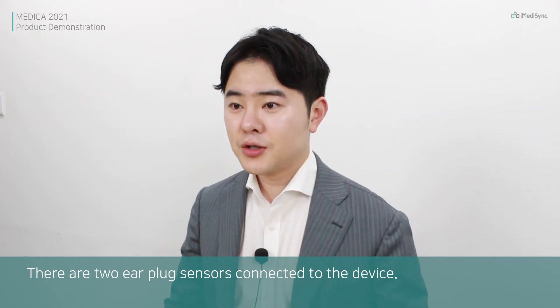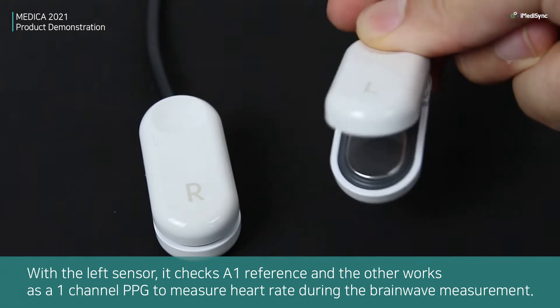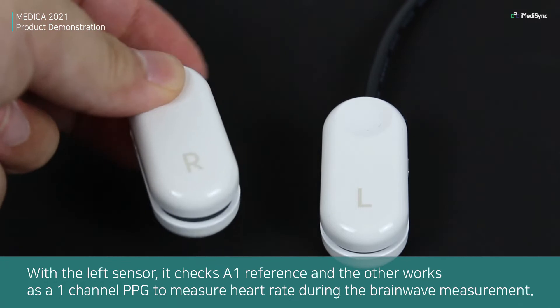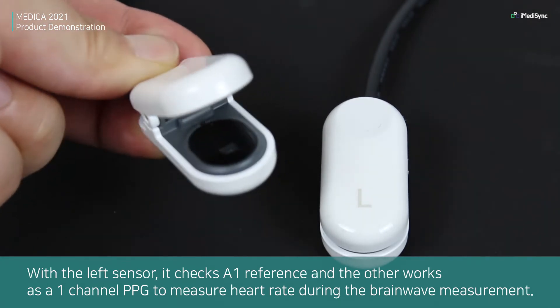There are two ear-plug sensors connected to the device. The left sensor checks the A1 reference, and the other works as a 1-channel PPG to measure heart rate during the brainwave measurement.